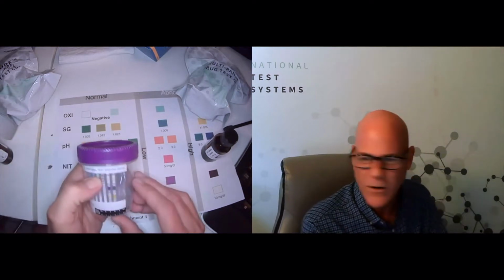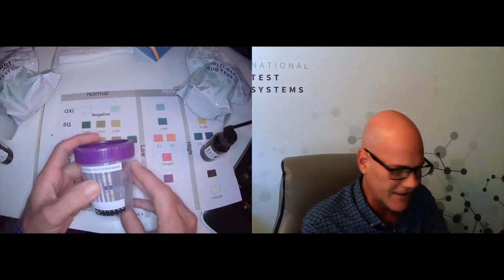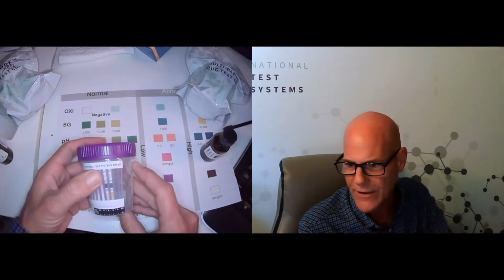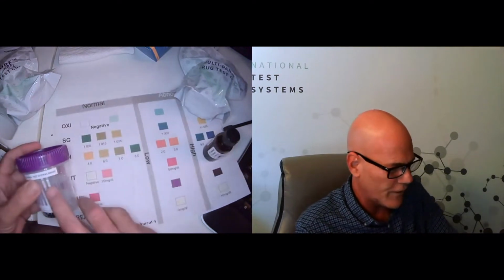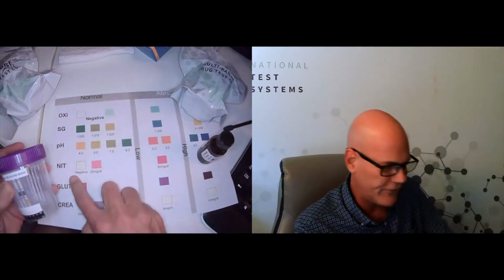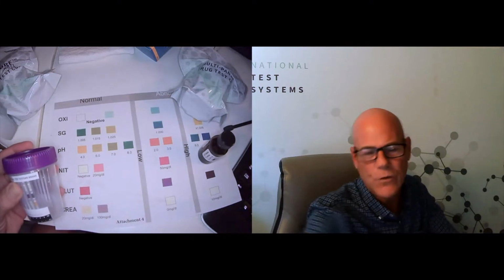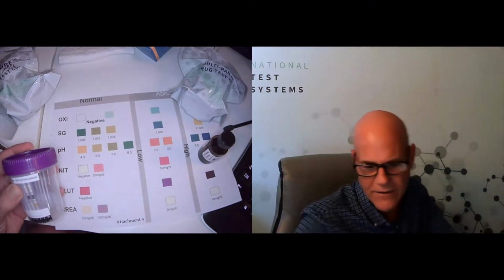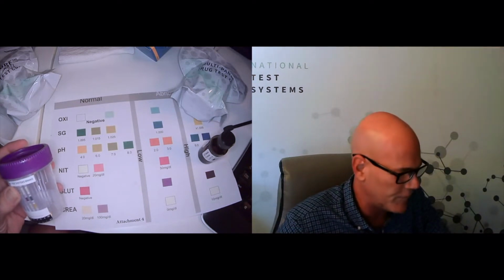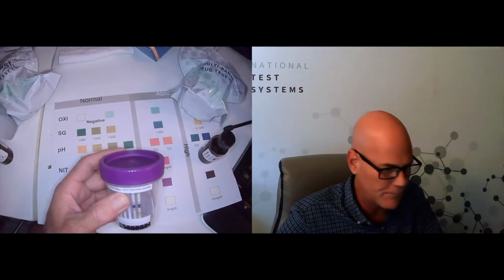All right, so the first one on the upper left here is nitrites. And I don't think you guys are ever going to get a crisp camera view, but you can kind of see the colored pad here. I'll try and keep the glare off it. So nitrites looks pretty much just off white. And if we look at our chart here, we see nitrites just off white equals negative. And then if we look back to attachment 2 for the controls on nitrites, they say control A should be negative. So good, we see that. And that color matches a negative on that parameter.